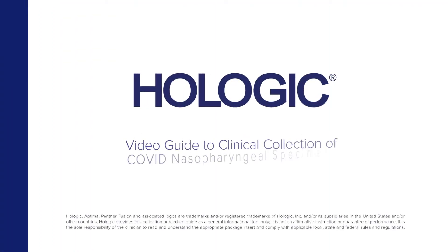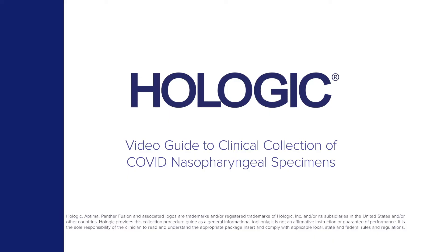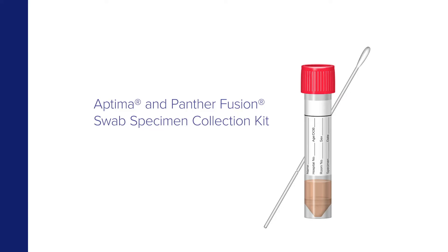Hologic presents a video guide to the collection of COVID nasopharyngeal specimens by clinicians using the Aptima and Panther Fusion swab specimen collection kit.